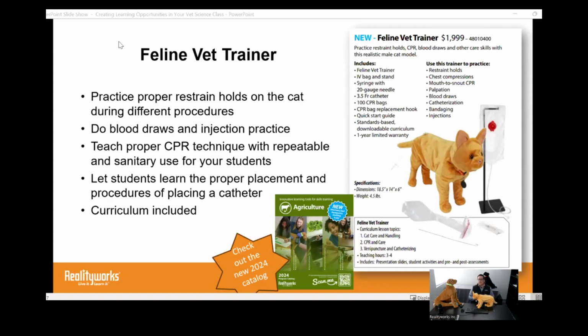When we start talking about the feline vet trainer, one of the things we want to point out is that it is a male cat. We did that purposely. We wanted it so you can catheterize it. The other piece is we wanted it so you could do proper restraints, proper holds. It does move. There are movements in its front legs and its back legs, and being able to move the cat into positions and have it move very realistically in that sense.